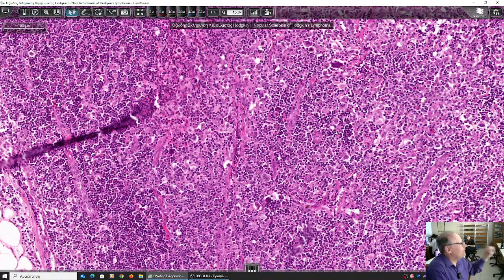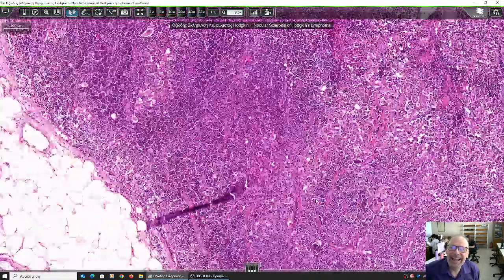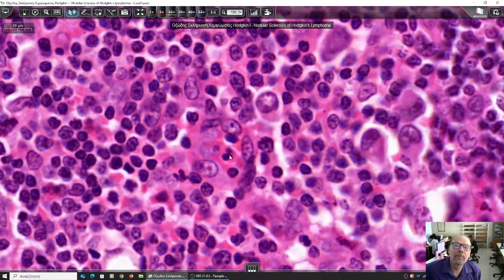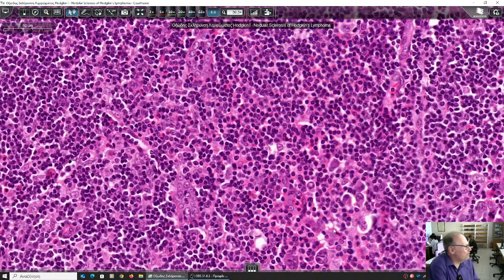Okay, so what are these cells doing there? Look, all these eosinophils and possibly some neutrophils. These are not the neoplastic cells. These are the reactive cell population. Because the neoplastic cells are malignant cells, they give a sign to the other cells of inflammation and immunity to go there and be the reactive cell population.